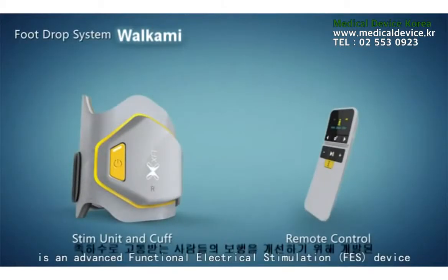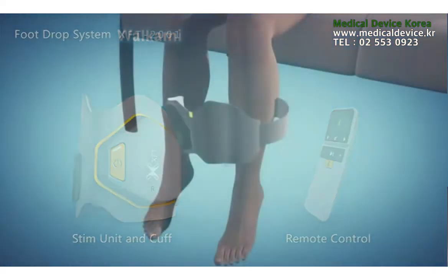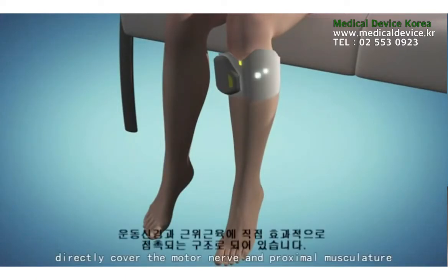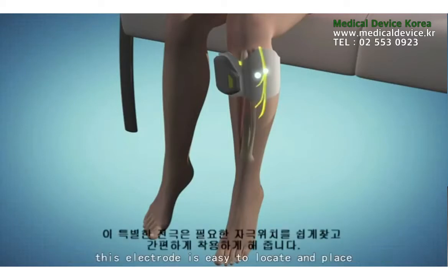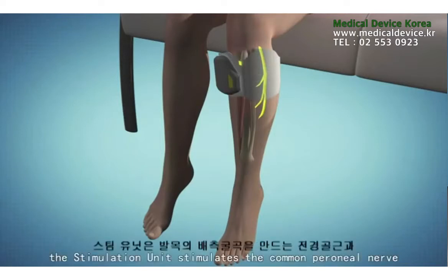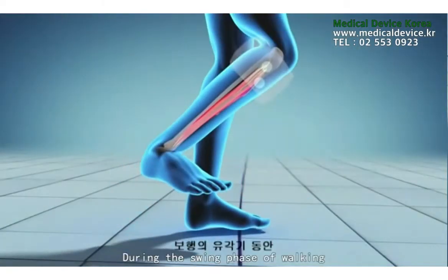The XFT-2001D foot drop system is an advanced functional electrical stimulation (FES) device designed to improve gait in people suffering from foot drop. Quick-fit electrodes are specifically placed near the head of the fibula, directly covering the motor nerve and proximal musculature. This electrode is easy to locate and place. During the gait cycle, the stimulation unit stimulates the common peroneal nerve, which innervates the tibialis anterior and other muscles that produce dorsiflexion of the ankle during the swing phase of walking.